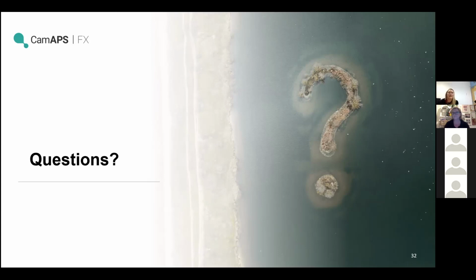I think if someone is new to pumps, transitioning from MDI, you definitely want a short period of just optimizing those normal pump settings, because as Charlotte was saying before, if the system does flip out of auto mode into open loop, you want to know that those pump settings are there or thereabouts. So if someone's brand new to a pump, you'd probably want to optimize those for a week, 10 days or so, till you're happy with the basals particularly. Even if you were on a pump before and confident your carb ratios were right, when you go into closed loop you often need to adjust the carb ratios anyway, because the insulin's just being delivered in a different way.